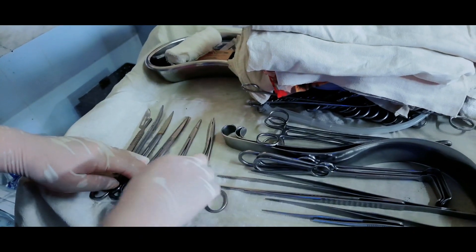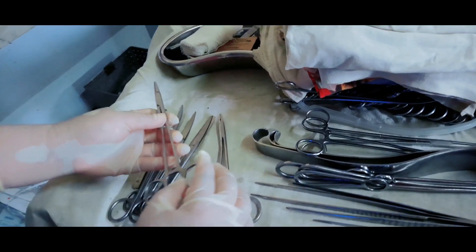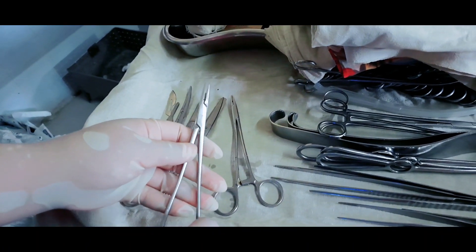Needle holder has different shapes and sizes. I have two needle holders here — one curved and one straight — used for stitching.